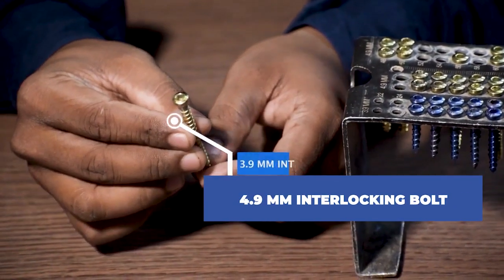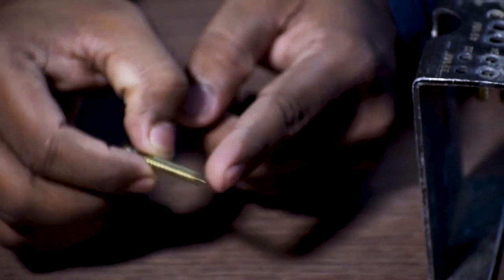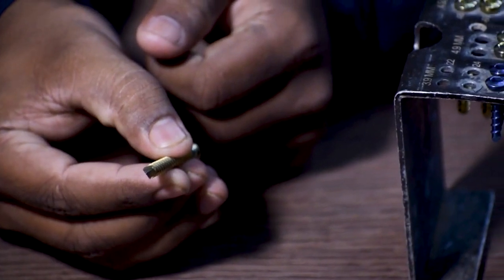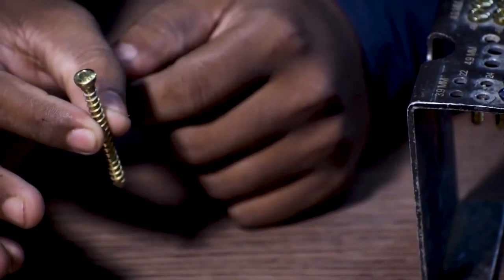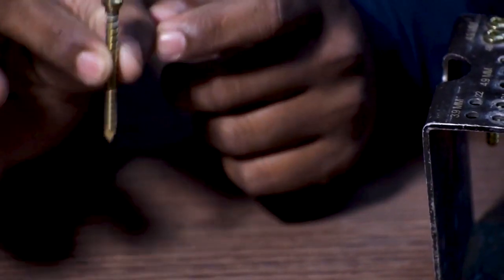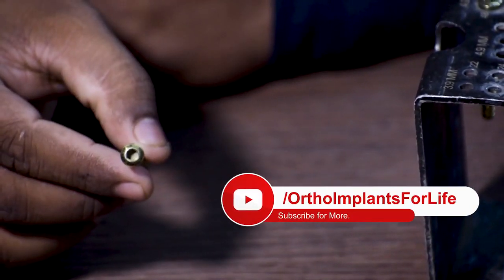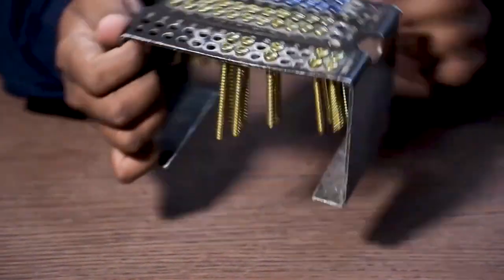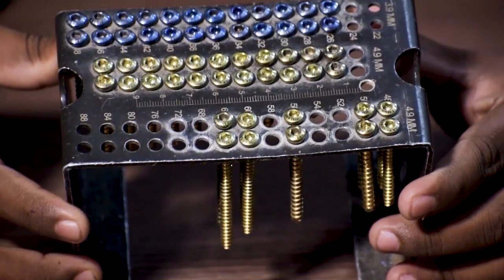This is a 4.9 mm interlocking bolt. This is fixed in the 9 mm and 10 mm diameter nail in the distal part. It is also used in the proximal part of the 8 mm, 9 mm, and 10 mm nail. It is available in lengths from 26 mm to 65 mm, with a gap of 5 mm between each length.